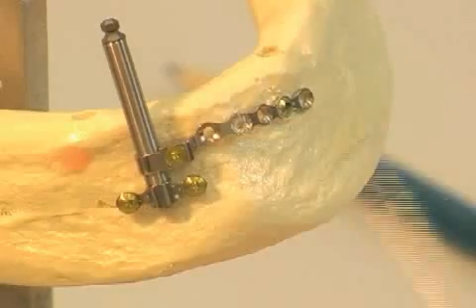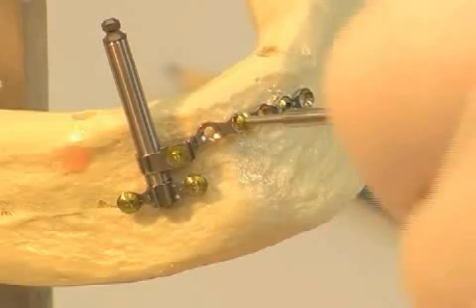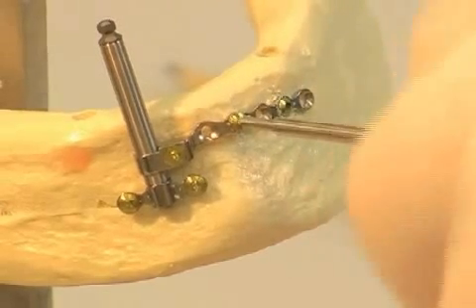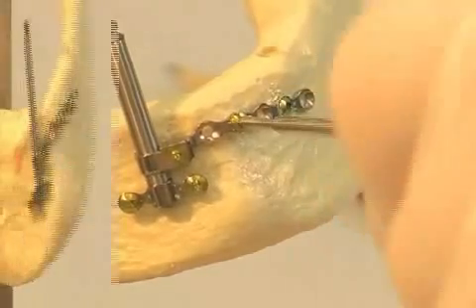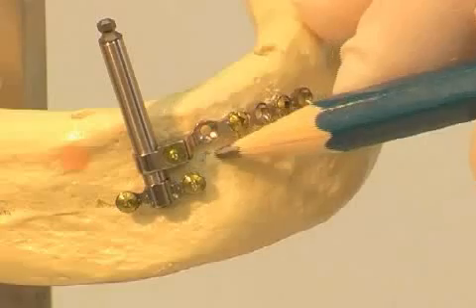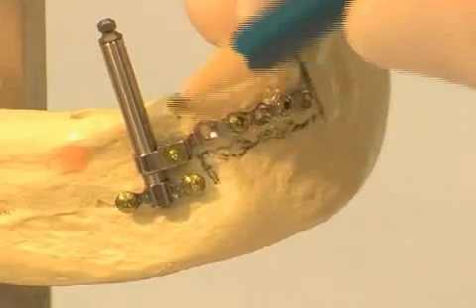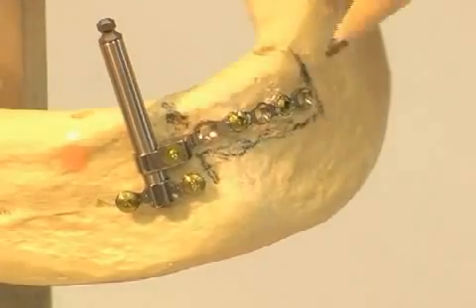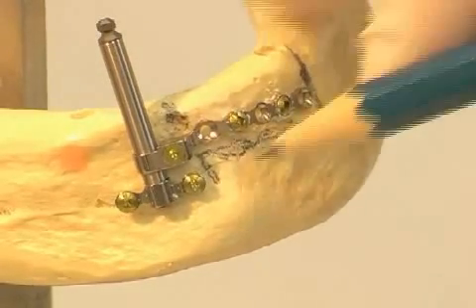Later on, when the bone has fully regenerated, all screws and parts will be removed. You now see how the last screw is being tightened. At this point in the procedure, we can see how the cut zone is determined — in this case, with a pencil. The framed bone block will later be moved upward, which will ultimately correct the jaw defect.